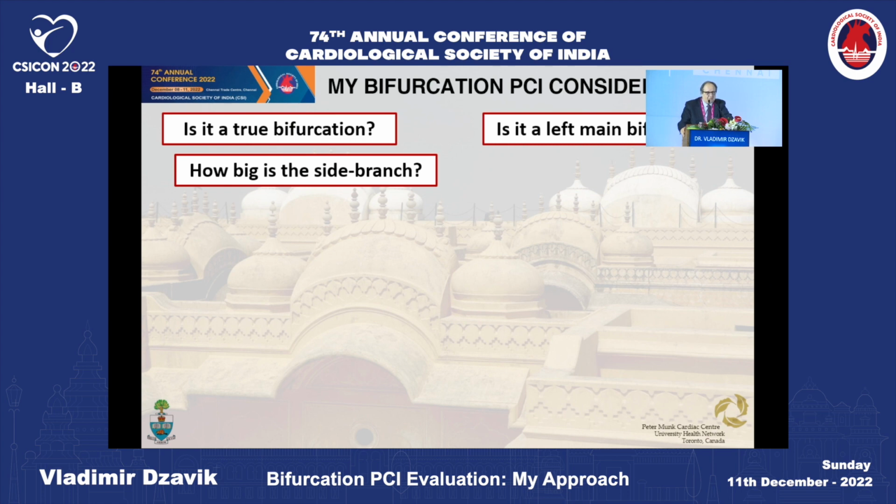If it's a left main true bifurcation, oftentimes we are going to be choosing a two-stent technique up front, not always. A very discrete stenosis at the ostium of the side branch does not necessarily mean that you need to put a stent in it, because a provisional approach with a nicely deployed main vessel stent with a distal recrossing, and the scaffolding that you can achieve at the proximal edge of the side branch, often works very well in a situation like that.